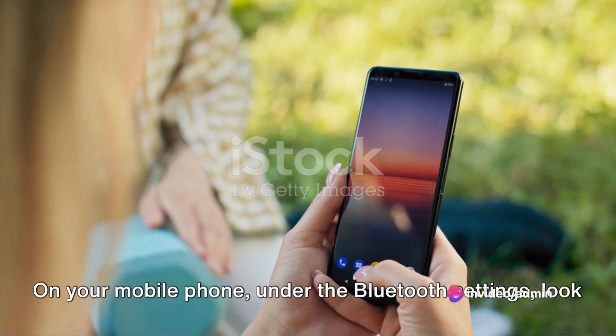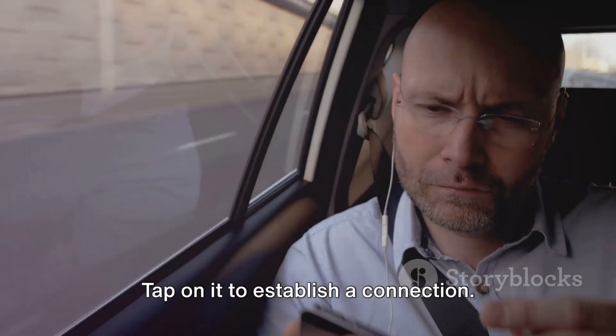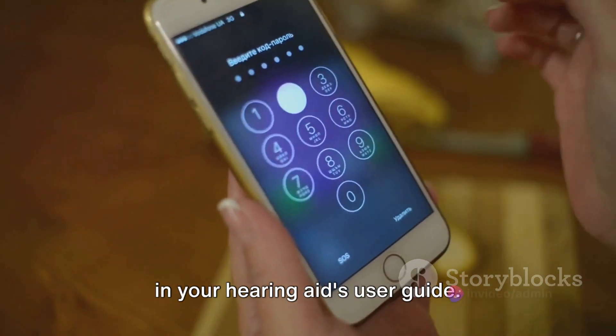Now it's time for the magic to happen. On your mobile phone, under the Bluetooth settings, look for your hearing aid's name or model number. Tap on it to establish a connection. You may need to enter a passcode, which should be available in your hearing aid's user guide.